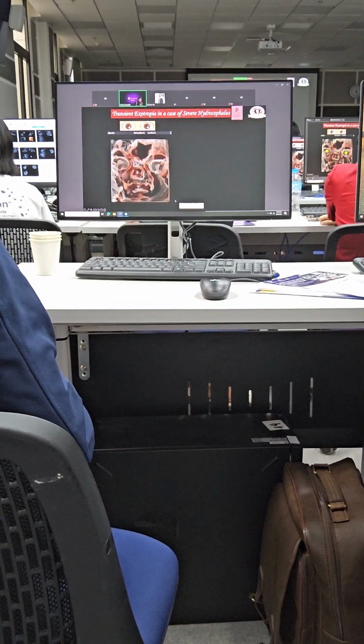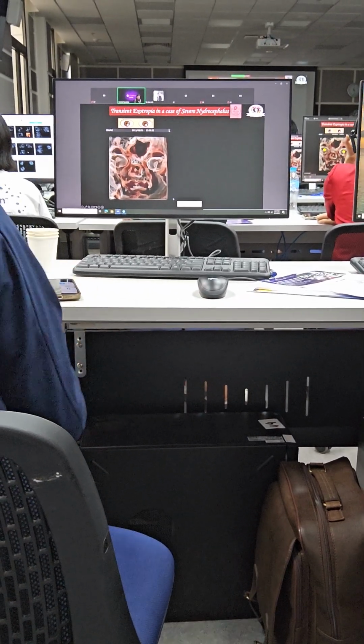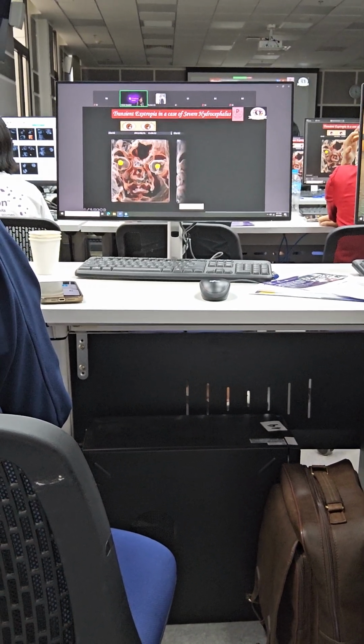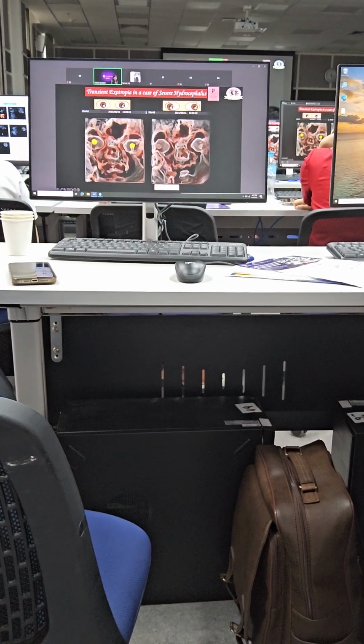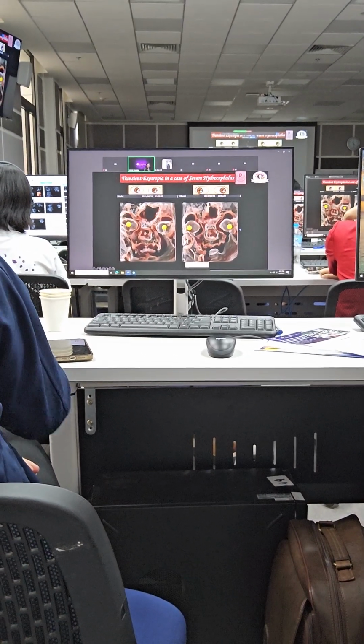Here this is the normal location of the lens, but here you can see this is a transient exotropia in the case of the severe hydrocephalus. This is like this.